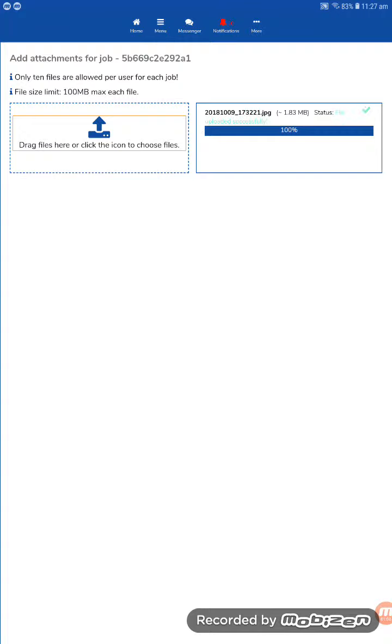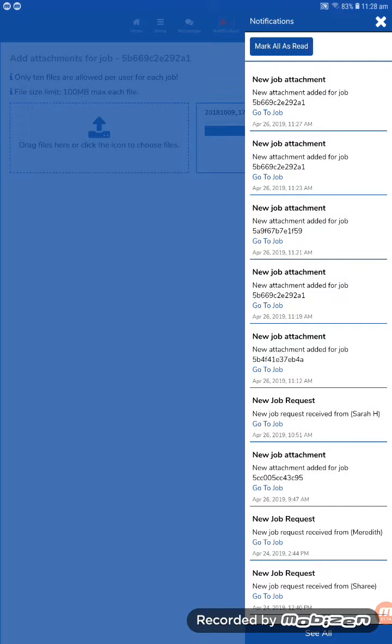Once it's done, a notification is sent to all relevant parties notifying of a change to a case or an update to a job form. Let's click on the notifications. We can see here at the top, new attachment for this job.